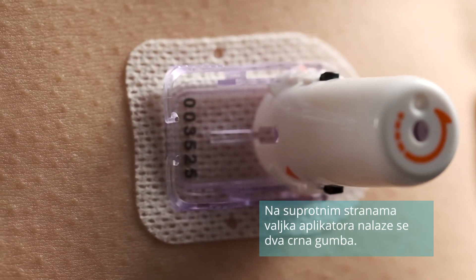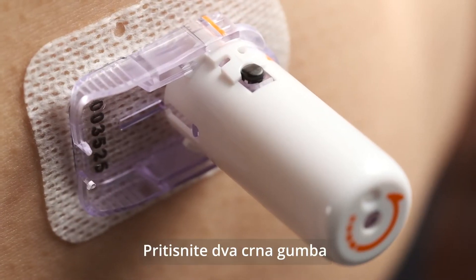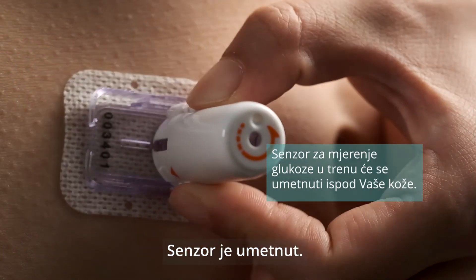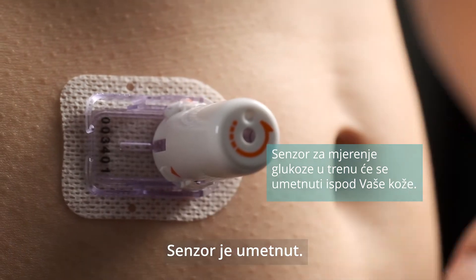There are two black buttons on opposite sides of the inserter cylinder. Press the two black buttons at the same time. The glucose sensor will be inserted under your skin in an instant.